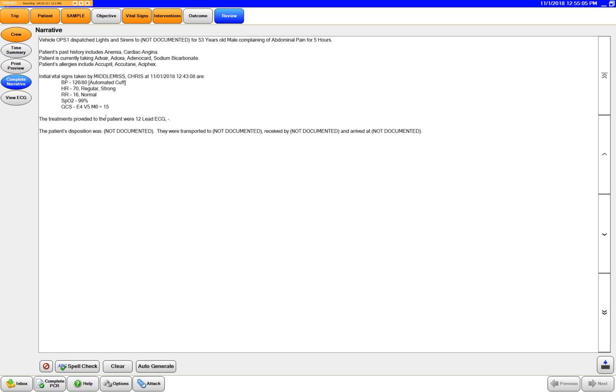And then here it's going to list your interventions. So here we did a 12 lead on this patient. If you generate this narrative to call the hospital to use this to kind of have a summary to give report and you're not quite done with your paperwork, that's okay. You can always just go back and you can add stuff.